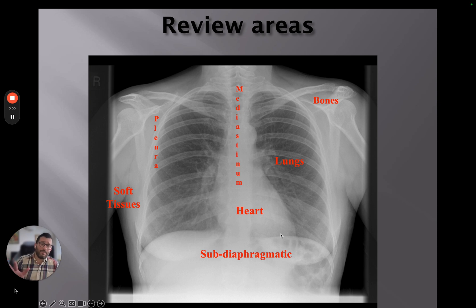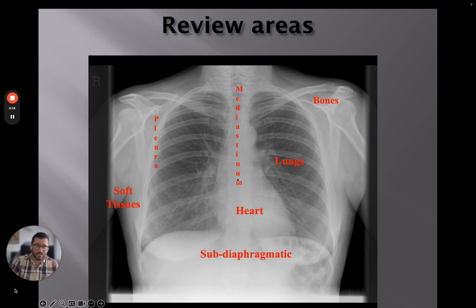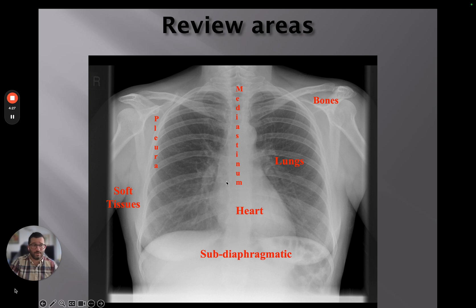I also look at the hilar regions again. These areas — behind the heart and the hila — are where you can sometimes miss pathology, so we want to give them extra care and attention. I'll scan down the lungs again before coming to any conclusions, making sure I'm looking at everything in the same way, with the trickier areas examined twice if not three times.